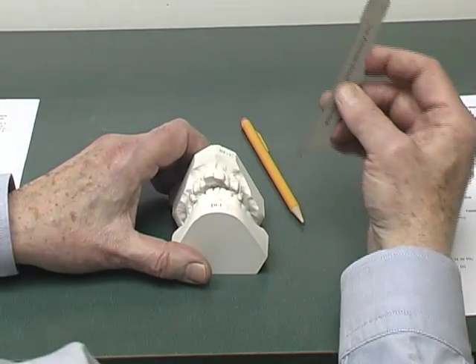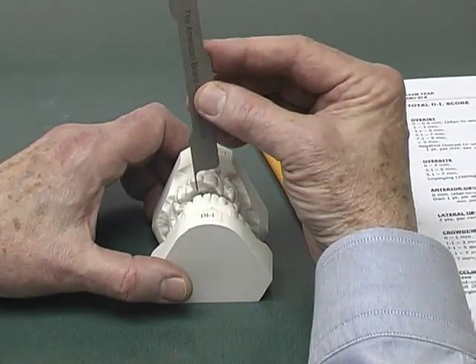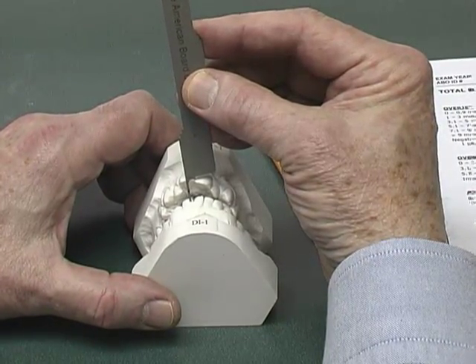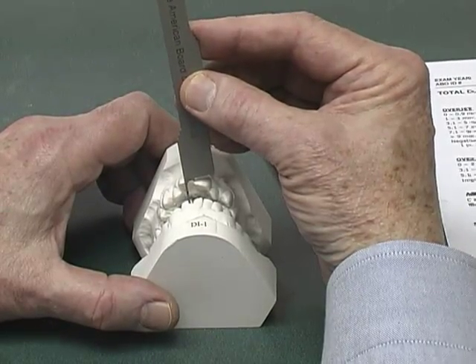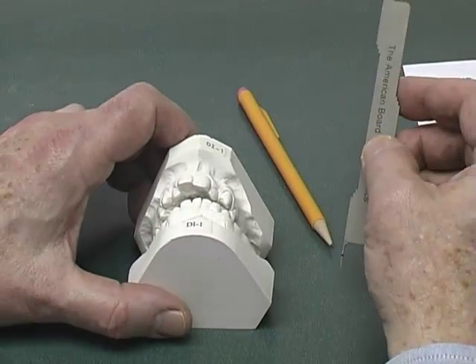We can see there's a significant overjet. Measuring that significant overjet with the help of our marks, we know that there's 11 millimeters, which is over the 9 millimeter limit. Therefore, there are five points that would be placed on the DI score for the overjet on this particular case.